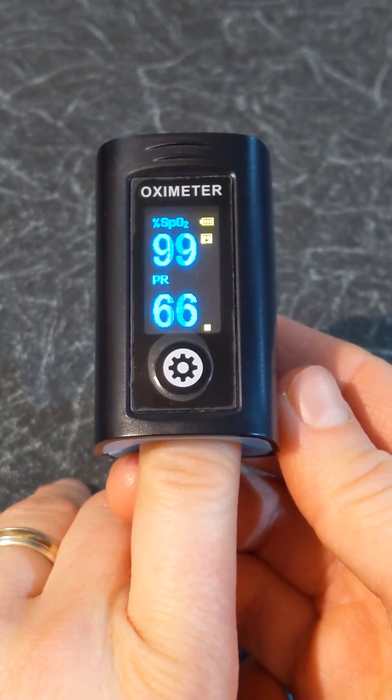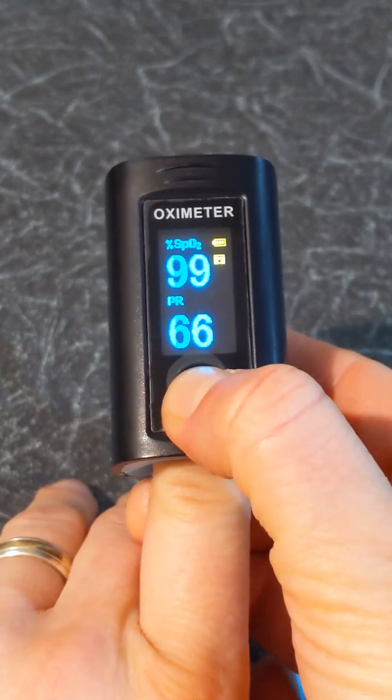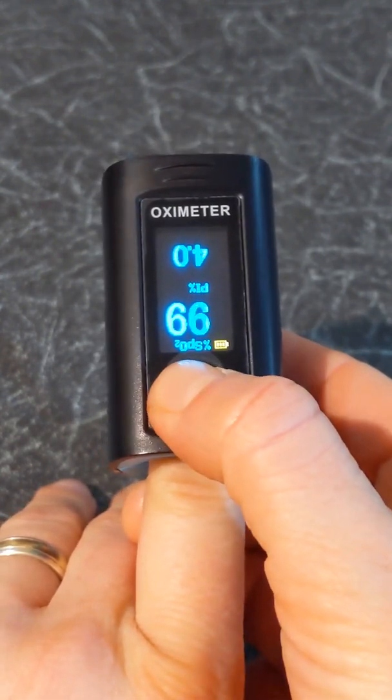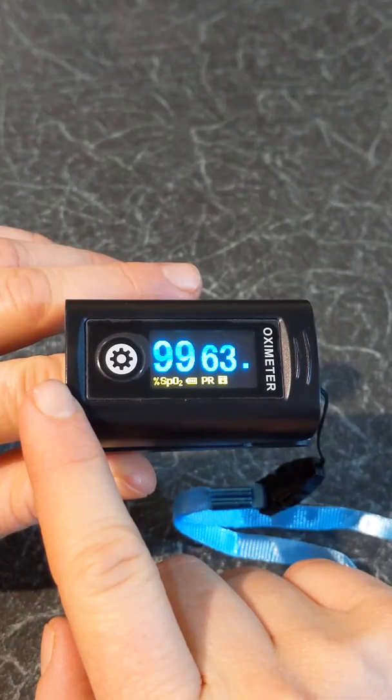While your finger is in, a short press on the wheel icon will change the display direction as illustrated. There are four displays you can choose from depending on the position of the person reading it. While your finger is in, a long press on the wheel icon will display the settings menu.